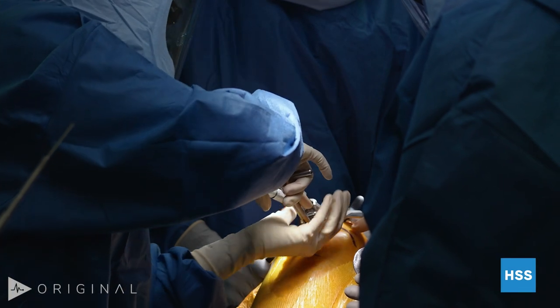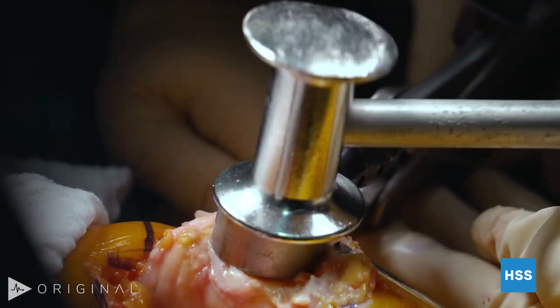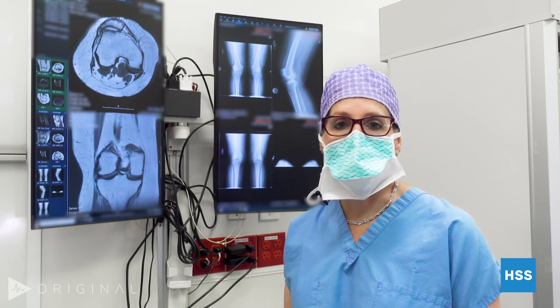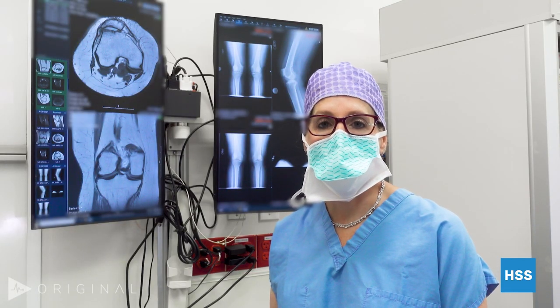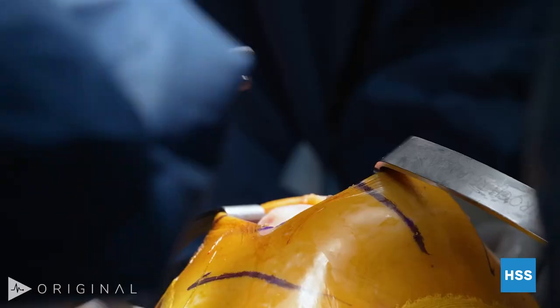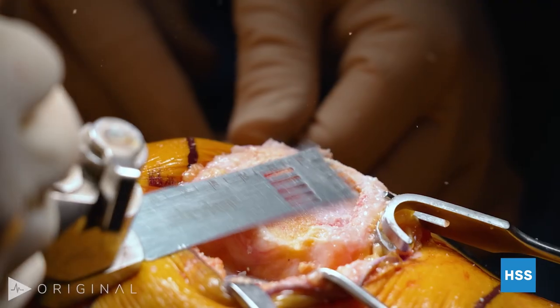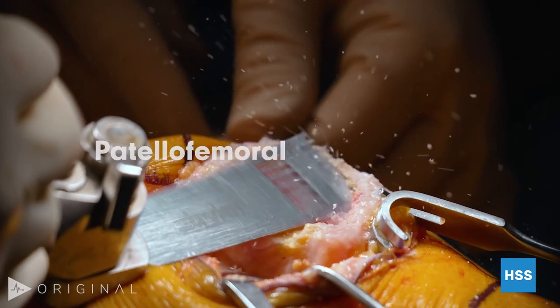Today we are operating on a 55-year-old woman who's had long-standing bilateral knee pain that has really been debilitating for her over the last 10 years. She can't kneel, she can't squat, she can't get out of a deep chair. She came to my office about a year and a half ago and we talked about non-operative treatment — we did injections and physical therapy — but the pain was still present and limiting her daily activities. So we concluded, after looking at her films and talking about the options, that she would be a great candidate for a partial knee replacement.